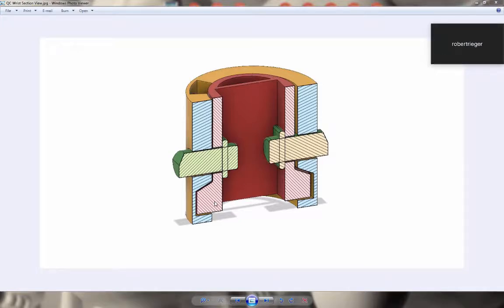I see. It looks like one of these detent buttons, like on a vacuum cleaner wand. When you stick sections together, they snap together. You push the button. Yes, sir. So I was misunderstanding. Those pins don't need to go in and out every time you want to attach this to an arm. They become basically buttons that you push in from the outside. Yeah, you push them in to pop the hand out, and then they'll push in automatically when you put it back in. That's what the bevel is on the top side of that. Actually, once the groove is flipped over, those bevels are going the correct direction. Gotcha.